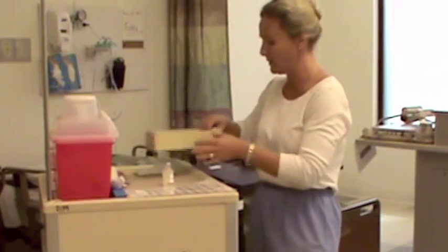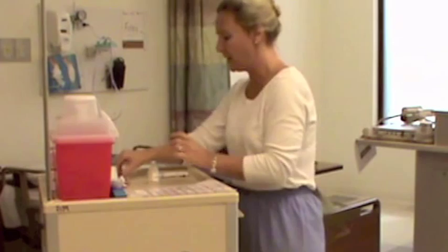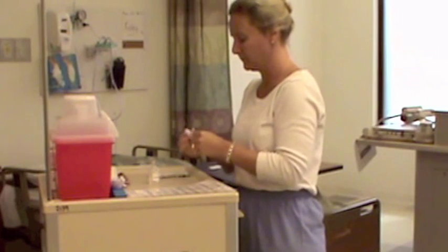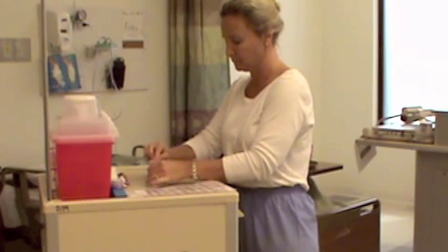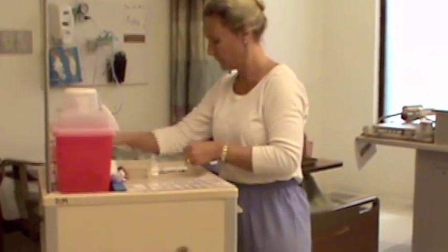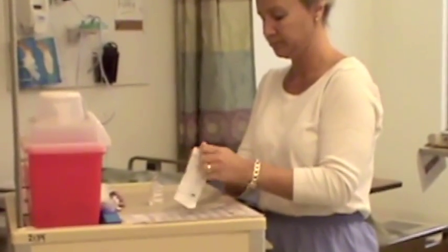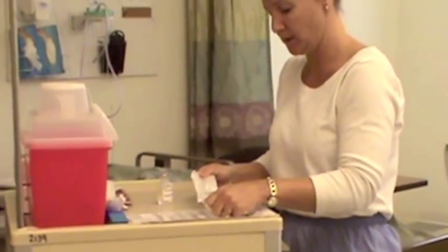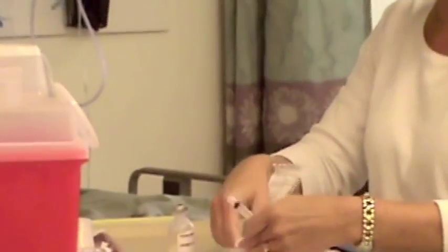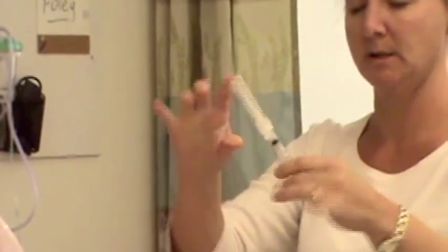Okay, so now I'm going to put my patient's drawer away. Just going to set it out of my way while I prepare. And I take my alcohol away, and I'm going to clean the top of the vial. And then I'm going to open my supplies and assemble my syringe and needle, keeping the hub sterile. Making sure it's nice and tight.